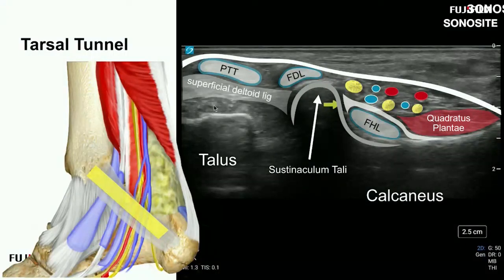So there's a deep and superficial inserting somewhere over here, but superficial to that, we have a tibiocalcaneal ligament that was the big guy, and then we have the posterior tibialis tendon superficial to that, flexor digitorum longus superficial to the sustentaculum tali of the calcaneus, and that landmark acts as this pivot point for the FHL to wrap around and make this turn with this bony acoustic backboard to provide that leverage that it takes to turn a corner.